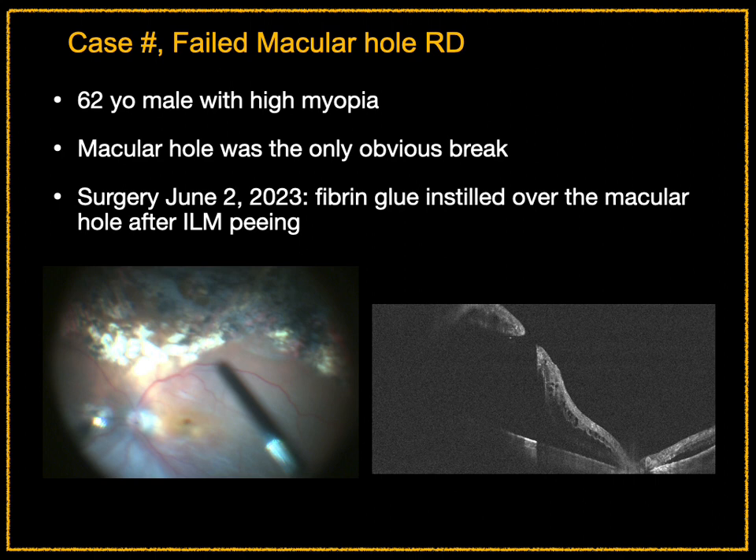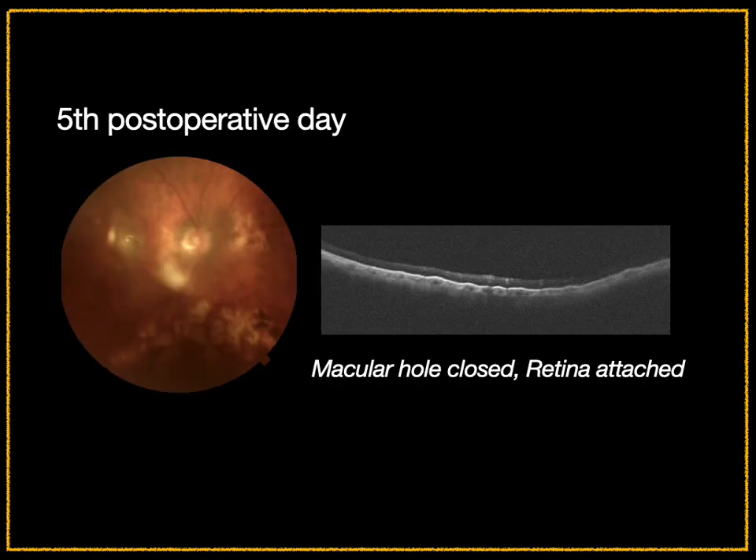This was a patient with high myopia who came with a failed RD; a macular hole was the only obvious break seen during surgery. After ILM peeling, fibrin glue was injected over the macular hole for additional security. By the fifth post-operative day, the macular hole was closed, the retina was attached, and the glue was no longer seen.